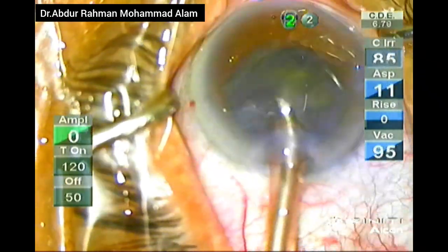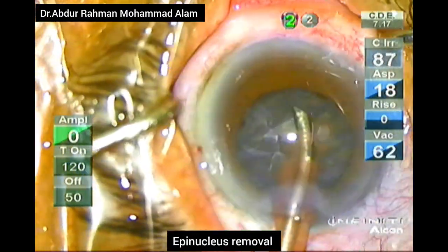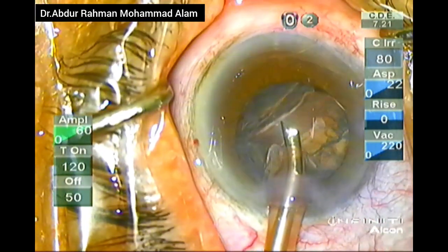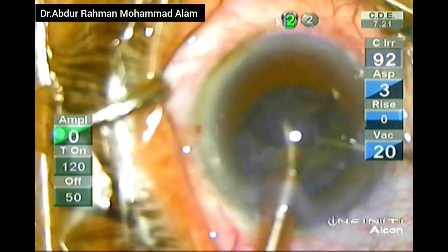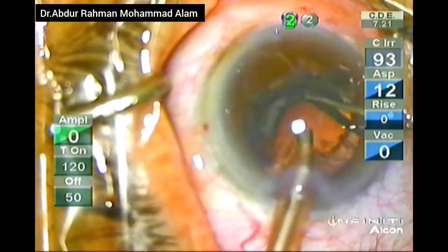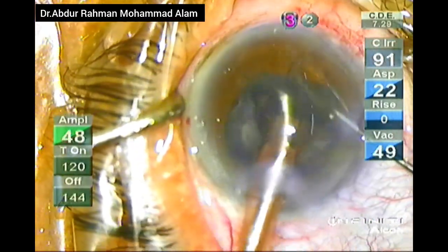At the end of nuclear removal, I switched to epinucleus mode to remove the remaining pieces because it is much safer in epinucleus mode. Now only the epinucleus shell is remaining, which will be removed with the help of the ball chopper. This ball chopper helps me to negotiate the epinucleus out of the capsular bag and it is easily phacoemulsified by the phaco handpiece.